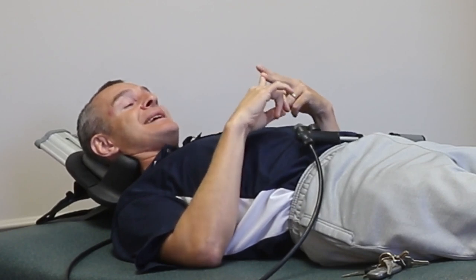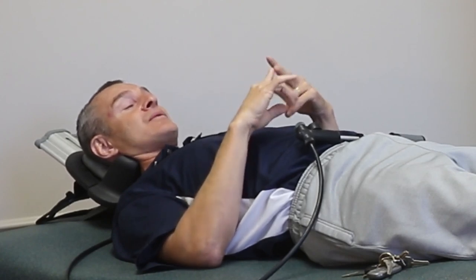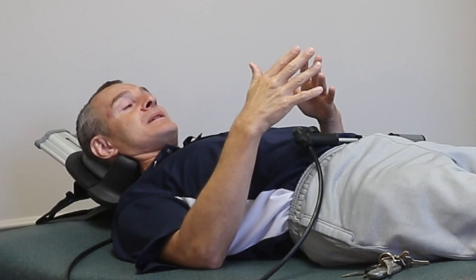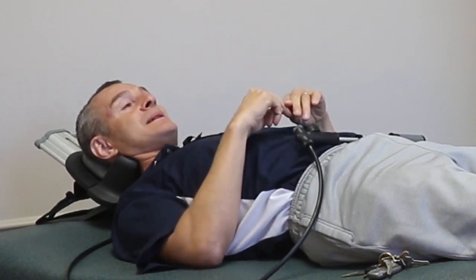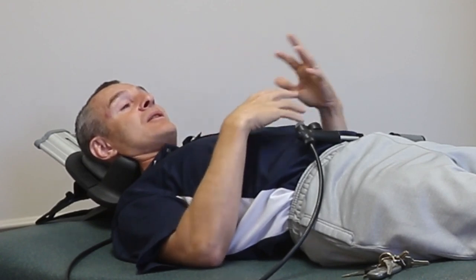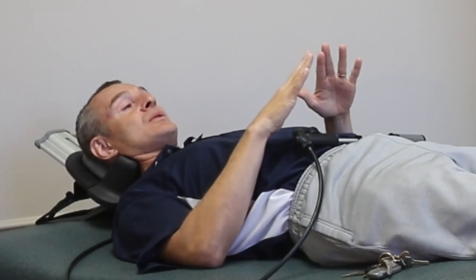We went up to the 8 or 9, max at 10 pound pressure for a 10 to 15 minute episode. And then we released the pressure back down for about 2 more minute recovery. All in all, you're looking at less than or about 20 minutes total.